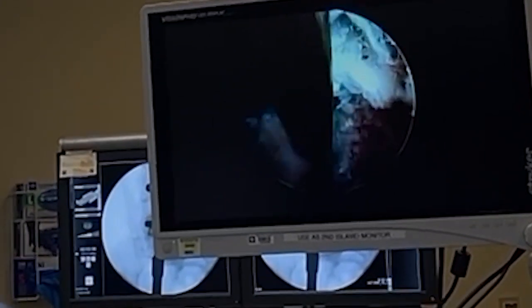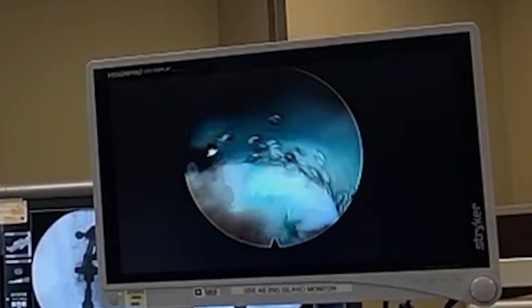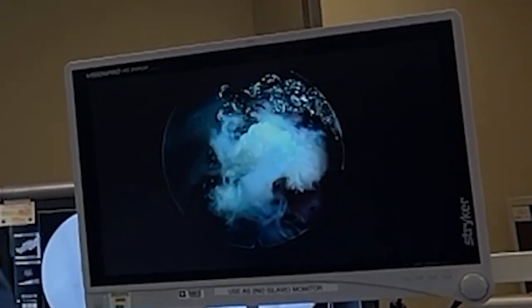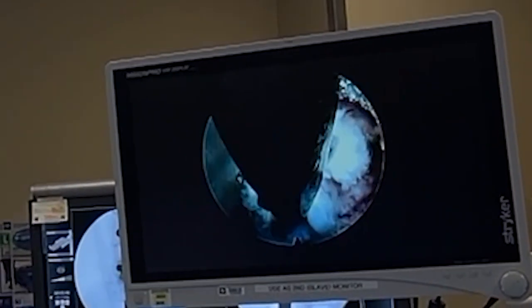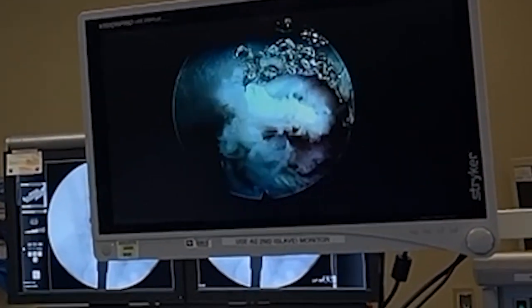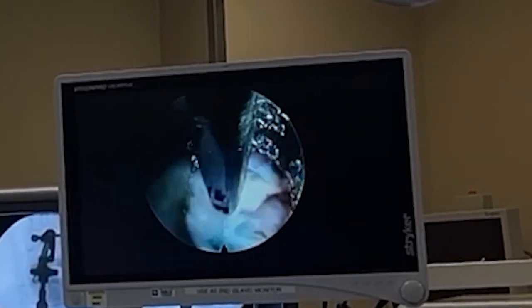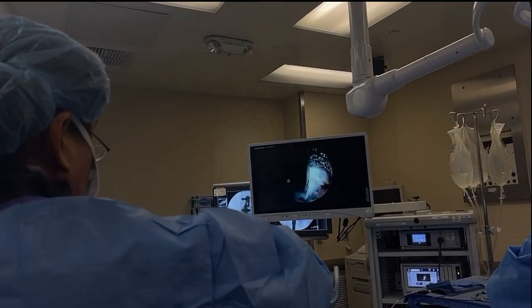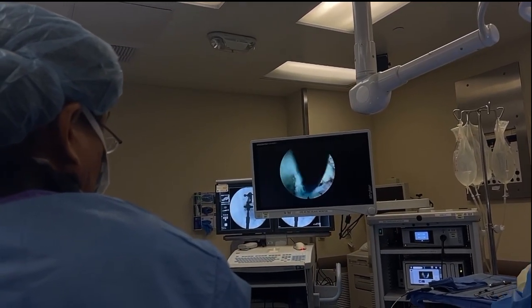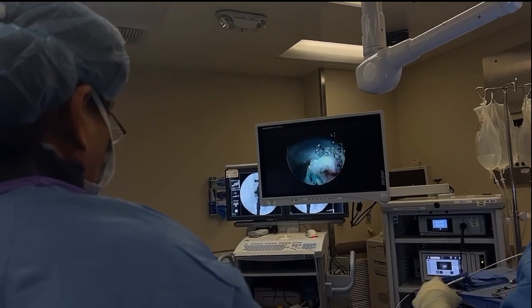We looked it up on the internet so it has to be true. Pimple popping at its best — I should start a YouTube channel. Oh yeah, never mind, I already do. You can already see it pulsating. Someday I'm going to design my own instruments that aren't so clumsy — look how awkward I am. They haven't changed the technology barely at all. All the new stuff — my custom instruments, the endoscope, the pituitaries, cannulas — are all virtually identical from the last 10 to 15 years. Sad but true.